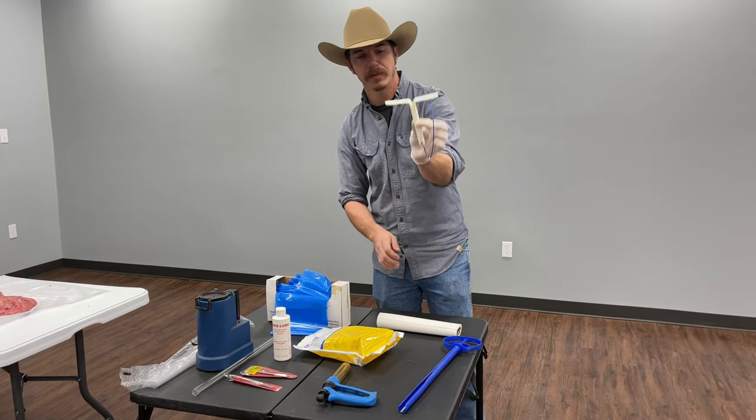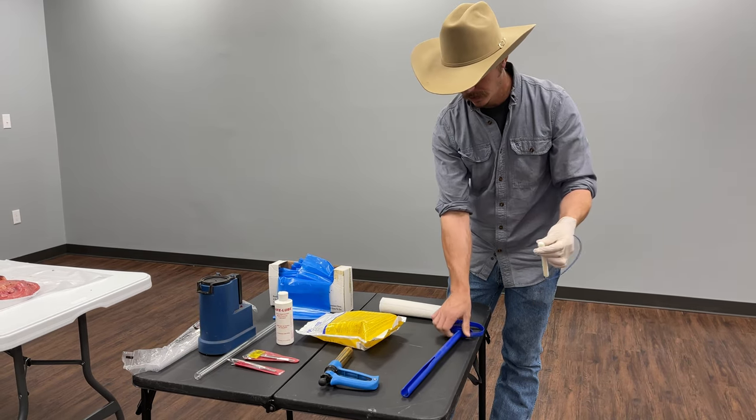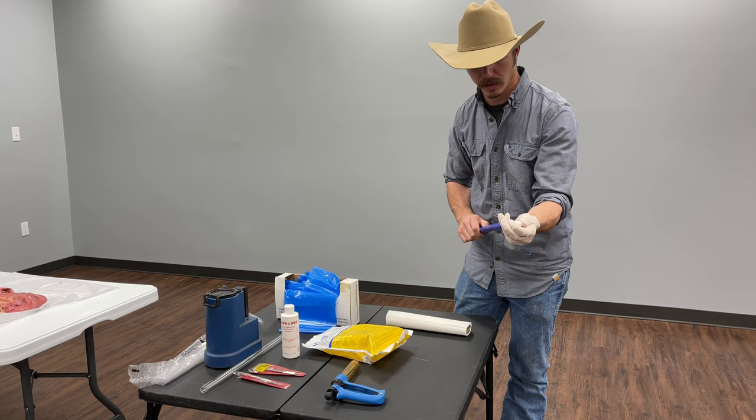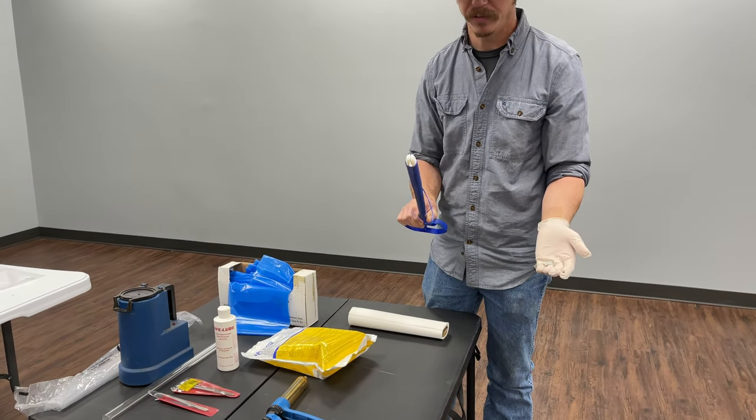You'll see there's this T-shaped device. You're going to fold the wings up on it and put it in the applicator, just like this. Then we're going to coat that with some kind of lube and insert it into the cow.